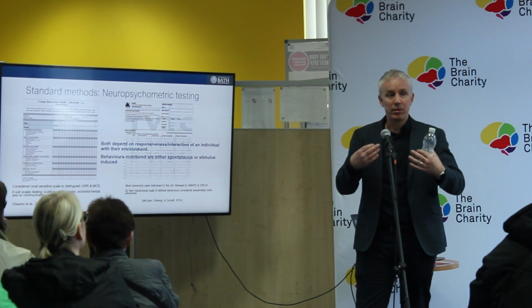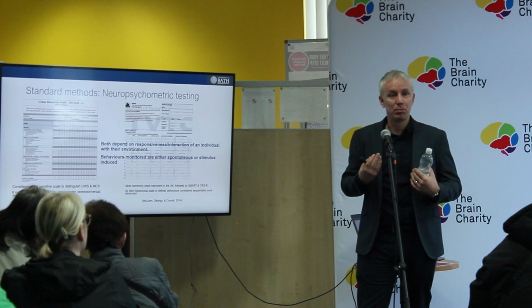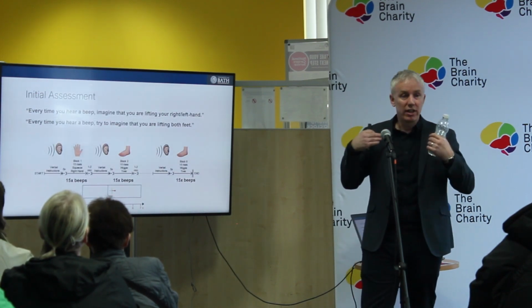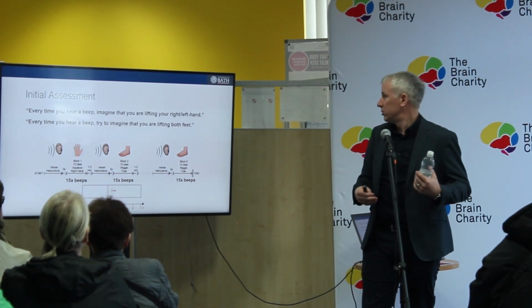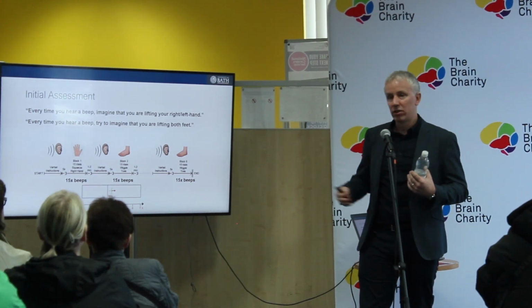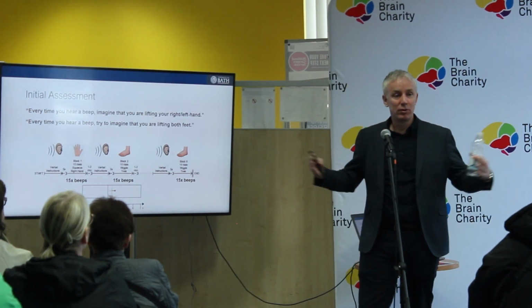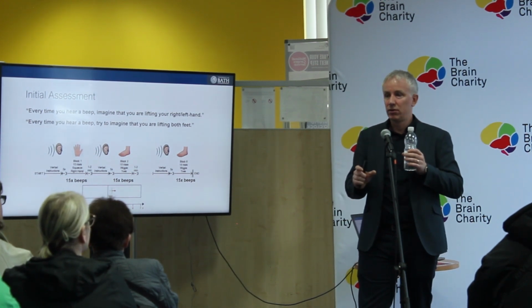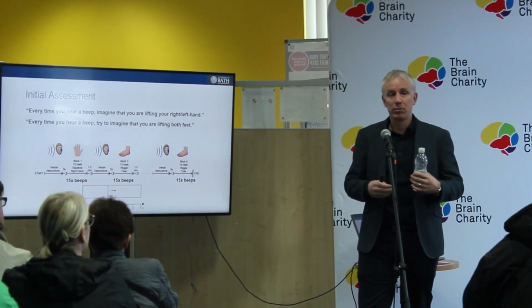So if you ask the person to imagine movement, even if they can't move, they can still try to engage the brain. And so what we've been doing is testing whether this can happen. So we put a headset on, we ask people to, every time you hear a beep, imagine that you're lifting your right hand or left hand. And we do that a number of times. Then we say every time you hear a beep, try to imagine that you're lifting your feet. And we do that a number of times, repetitively, maybe get up to 90 repetitions. And then we look to see, is there a difference between the feet versus the hand response in this person that's not able to respond?